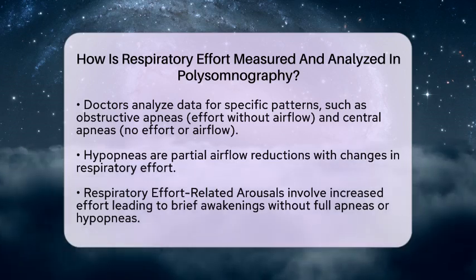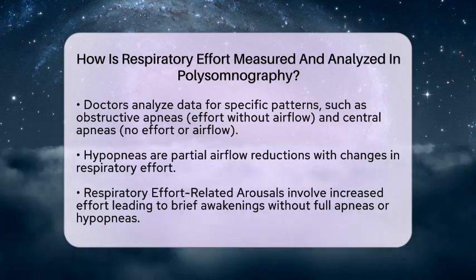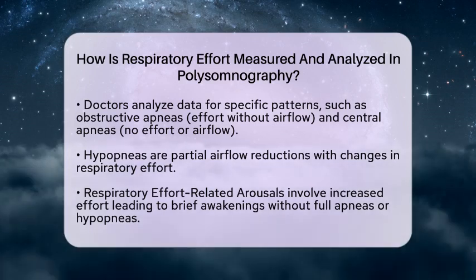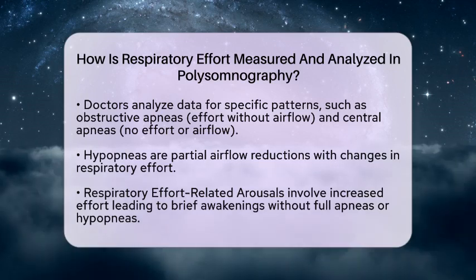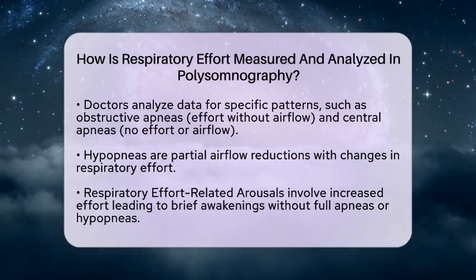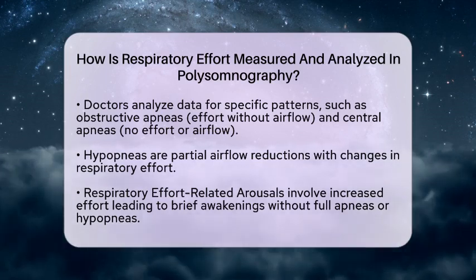When analyzing the data from these measurements during a sleep study, doctors look for specific patterns. For instance, obstructive apneas occur when there is continued effort to breathe, but no airflow. In contrast, central apneas show no effort or airflow at all. Hypopneas are partial reductions in airflow with changes in effort. There are also instances called respiratory effort-related arousals, where increased effort leads to brief awakenings without full apneas or hypopneas.